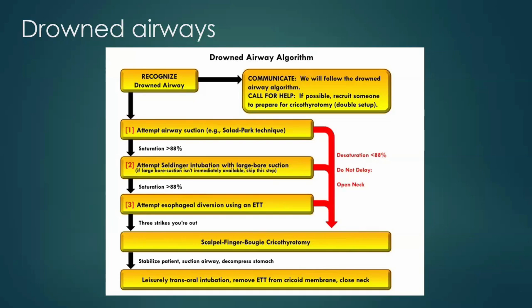So once again, if it's not prepped beforehand, it's not something that you're going to take the time to make in the situation. So usually if you see here, if they even say if large bore suction isn't immediately available, you just skip the step.